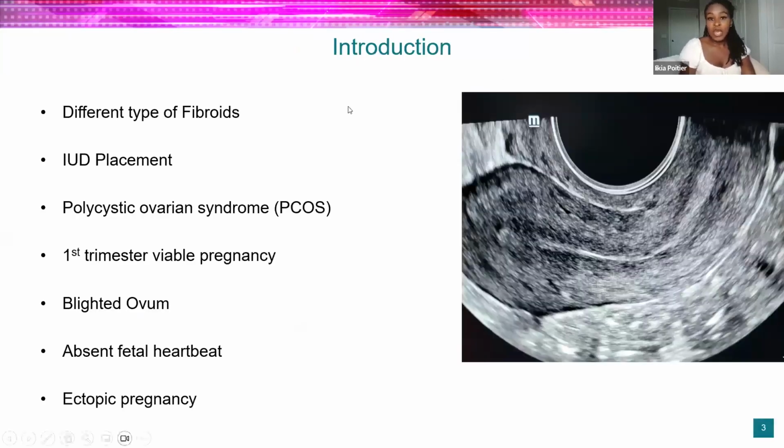All right. So what are we talking about today? We're going to talk about fibroids, all things fibroids, the different types of fibroids, IUD placements, PCOS or polycystic ovarian syndrome. We're going to talk about first trimester ultrasound, viable pregnancies, and those that aren't viable as well. We're going to talk about ectopics. We're going to talk about blighted ovum and absent fetal heartbeats, okay? All very important.